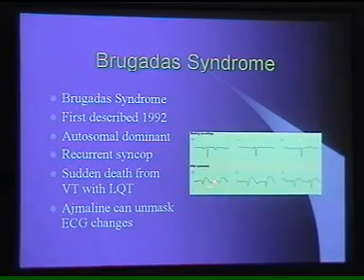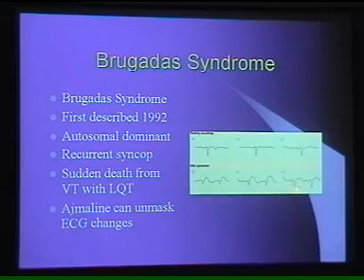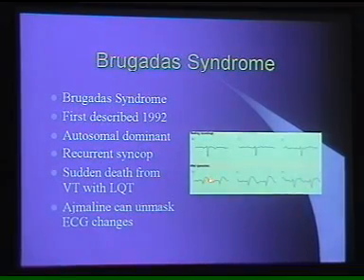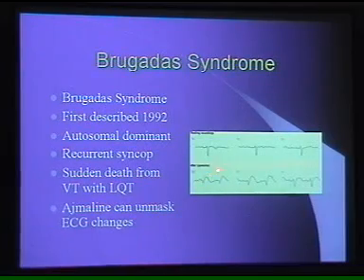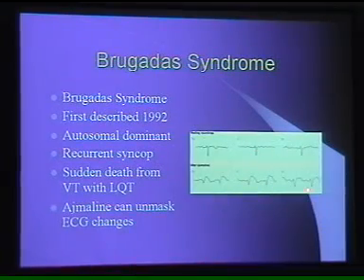Now, the typical ECG in these people shows abnormalities in V1, V2 and sometimes in V3, which has a high takeoff of T wave. Now that is the typical abnormality. ST segment and T wave have got merged into each other. Now this is the normal tracing on the top.